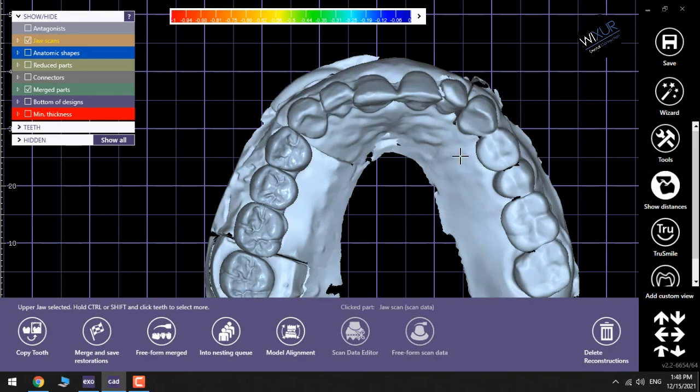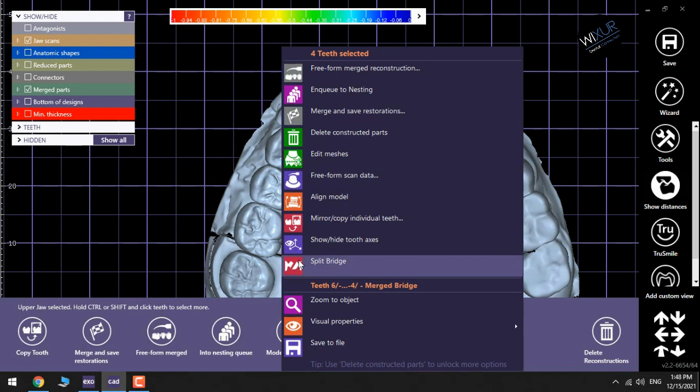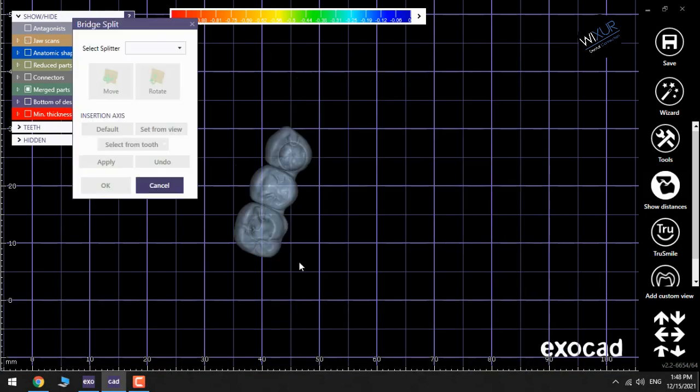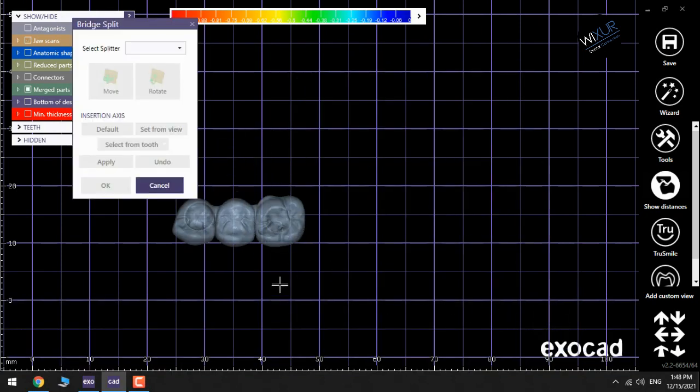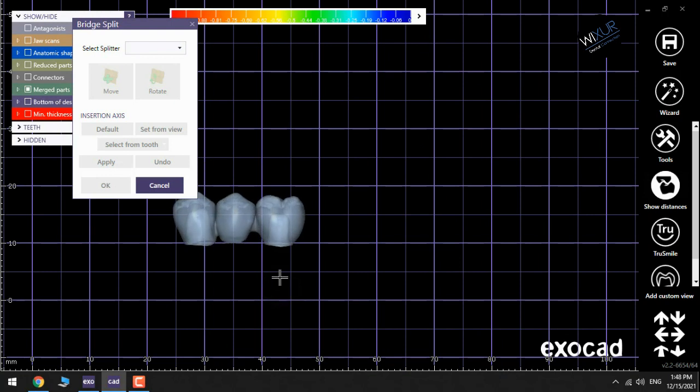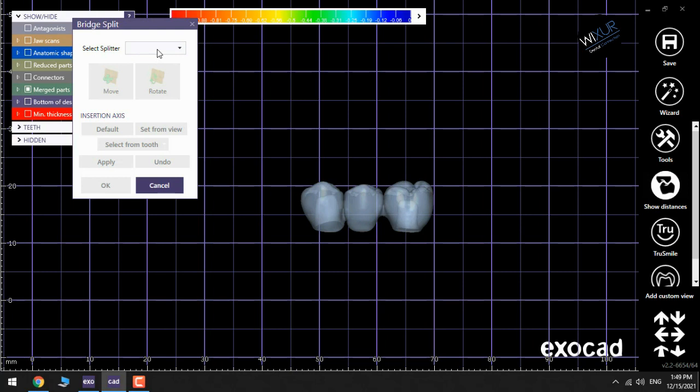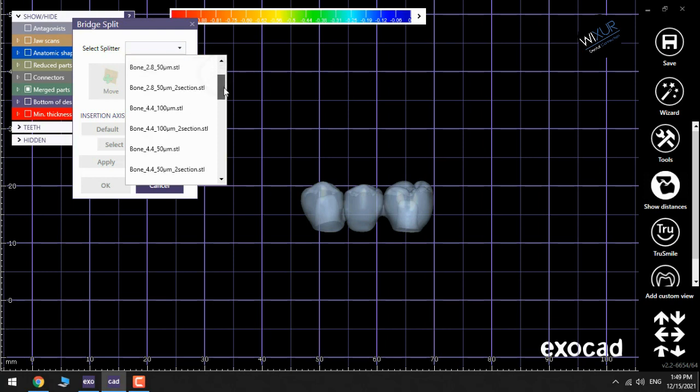Then I need to go to the expert mode, right mouse click on the bridge, then split bridge. Then the window pops up with the bridge split on the left side. As you can see, then I need to select the type of splitter.